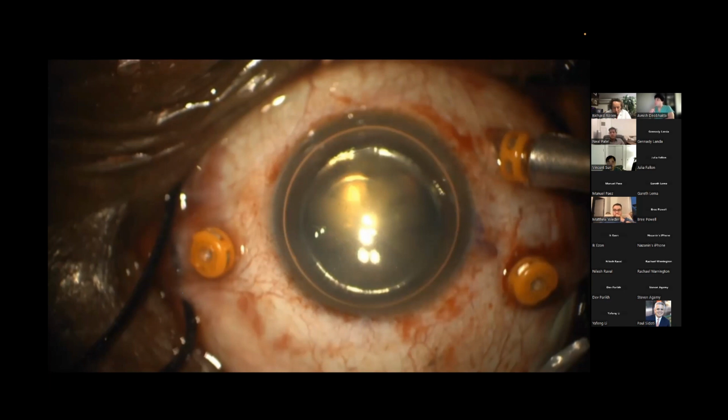So Vince, my message here is that even with a bad lens, whatever lens you have, don't touch it. Just finish the surgery. As Nish was saying, we're very close to the end. And again, if you definitely cannot complete the surgery, you can do a fluid exchange. You don't know what we see, you don't know if the retina is detached, so you definitely need to improve your visibility if that's the only chance.